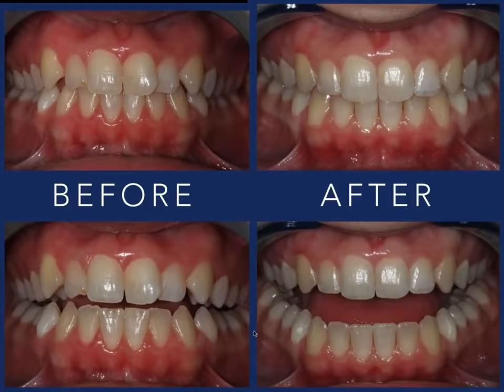Patients say, I was told I wasn't a candidate, and they look similar to this. And I'm going, golly, you're not only a candidate, but I think this could be done really quickly because we have mild to moderate crowding going on. I think if we expand those arches and give more room to the circumference of your arch, give you a more U-shaped arch, we're going to find some room here and get those teeth in the right position.